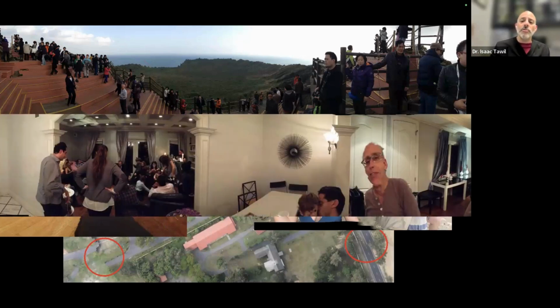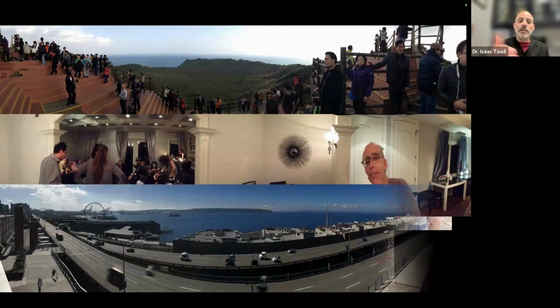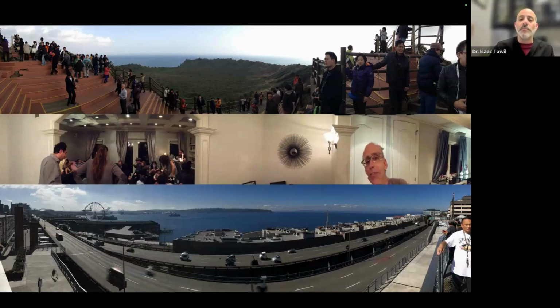If you look at this picture here, this is my father on the right side. He does not look like that. My child on the bottom does not look like that. My brother-in-law on the left side, his hand is not 2 feet long. This is the errors in stitching that we have. And when you go to the Santa Monica Pier, take a beautiful picture, it is not a U-shaped structure. We do not see cars that are shortened like that and elongated in others. This is the problem, because when you're stitching together, there's movement that's occurring.